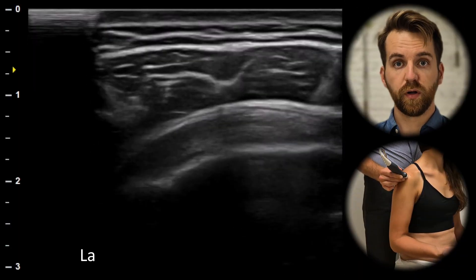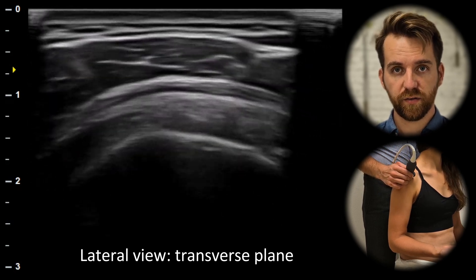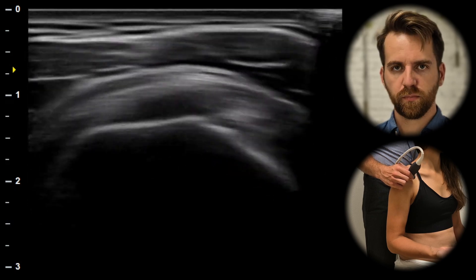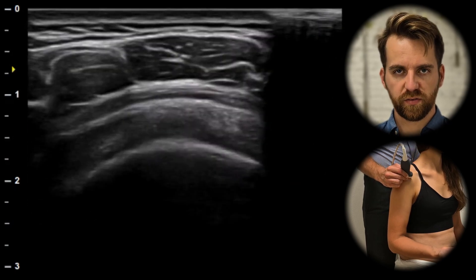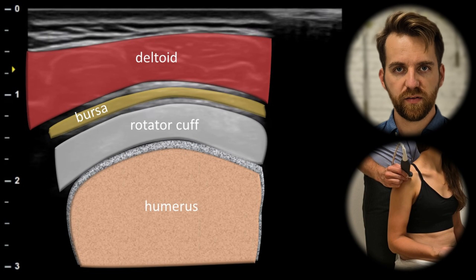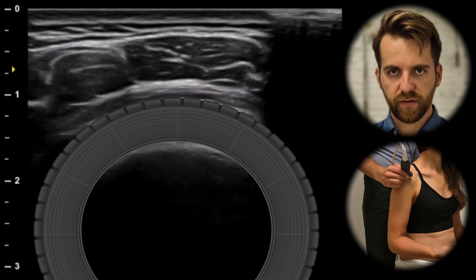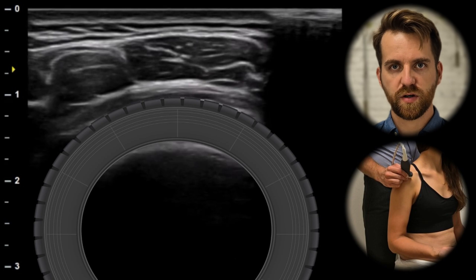Next, from the lateral view in the transverse plane, we can identify the rotator cuff in the short axis. Between the deltoid muscle and the rotator cuff we can identify the subacromial bursa. A healthy rotator cuff should resemble the appearance of a tire.